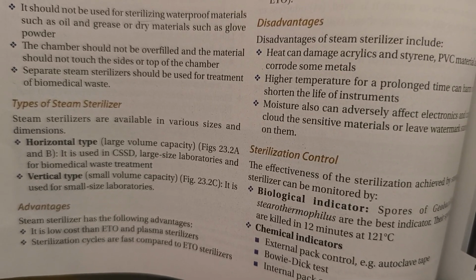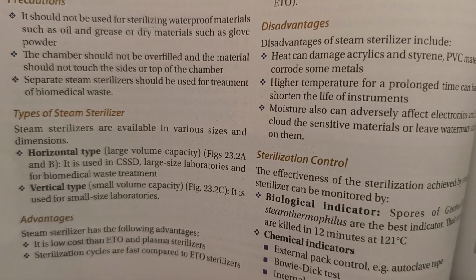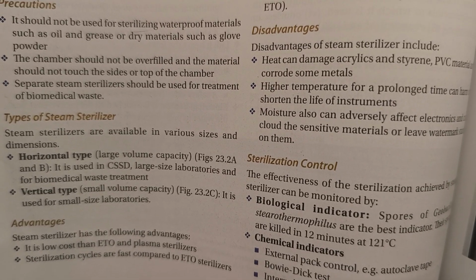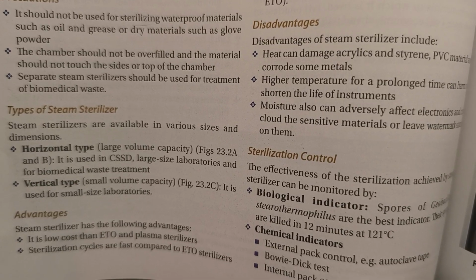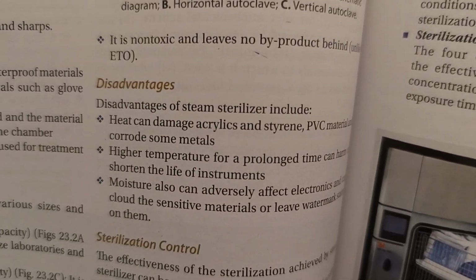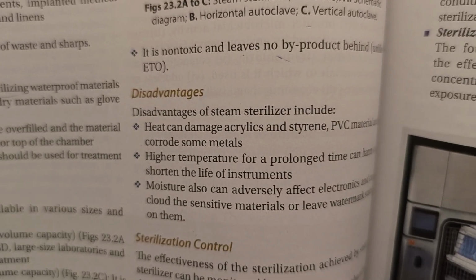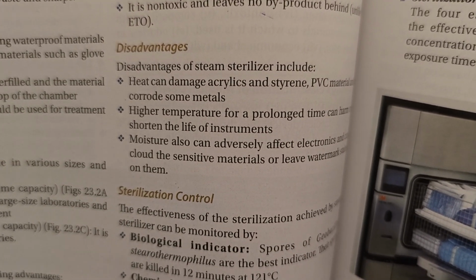Advantages. Steam sterilizer has the following advantages. It is lower in cost than ethylene oxide and plasma sterilizers. Sterilization cycles are fast compared to ethylene oxide sterilizers. It is non-toxic and leaves no byproduct behind, unlike ETO. Now disadvantages.